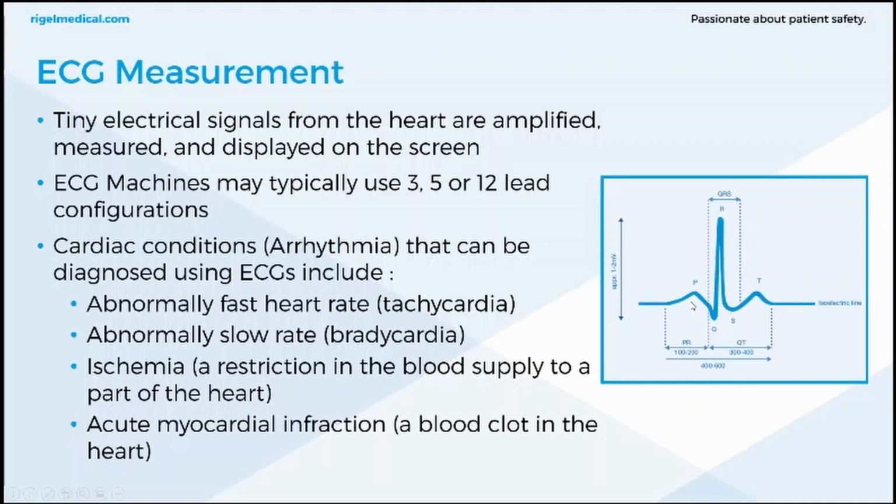And the way it does this is it looks for a QRS complex. If it detects a QRS complex, there's only a time delay when it can then produce a pulse. So it must perform within a very short delay after detecting the R wave.